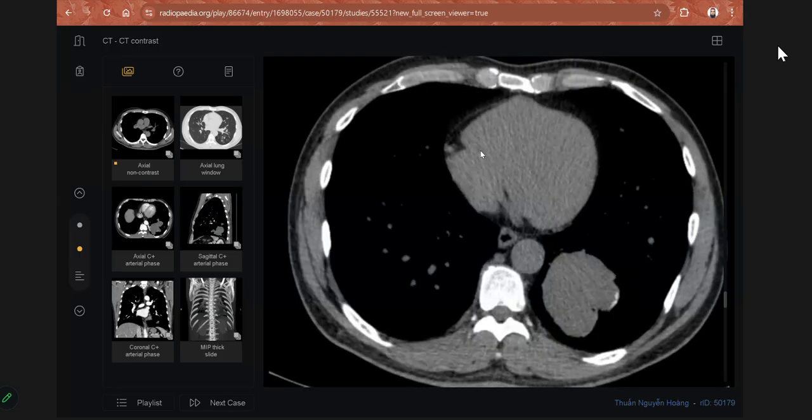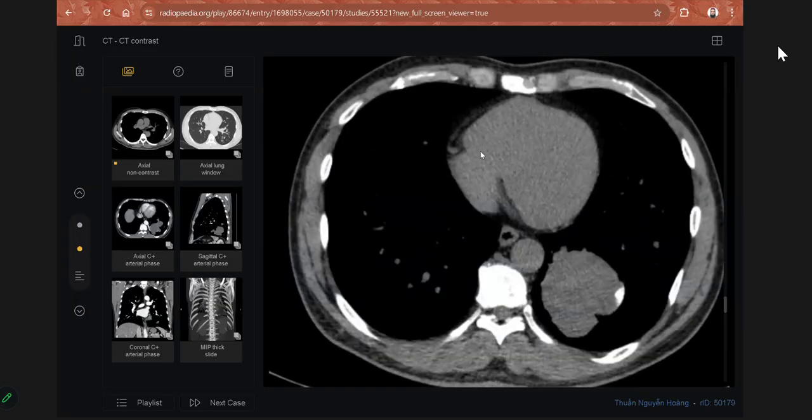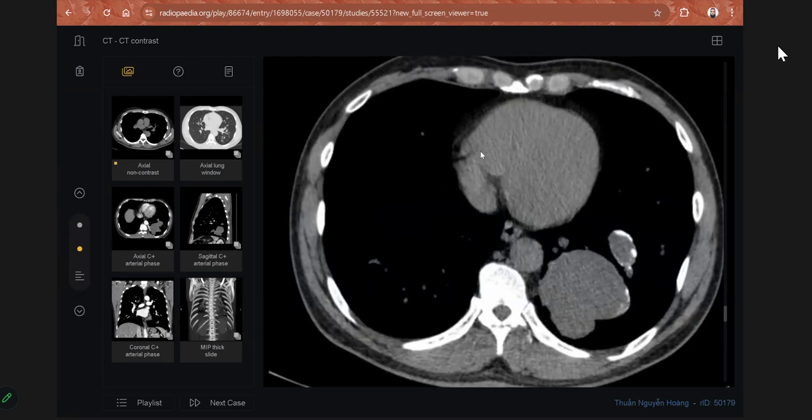As it's supplied from the aorta, I'm thinking of sequestration as my first differential. I would like to see if the patient has any prior imaging to compare. I would also like to see the post-contrast imaging and further refer and discuss the patient in a thoracic MDT. Okay, what do you want to see on the post-contrast? Sir, I would like to see this vessel that is arising from the aorta clearly, as I have seen it in the non-contrast. Okay, then the primary differential is sequestration.